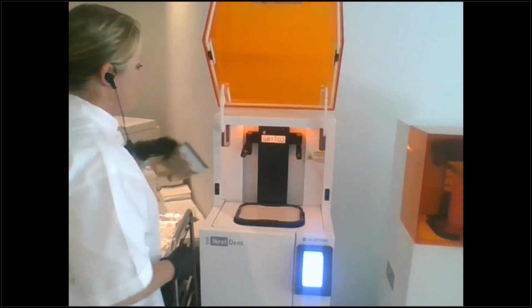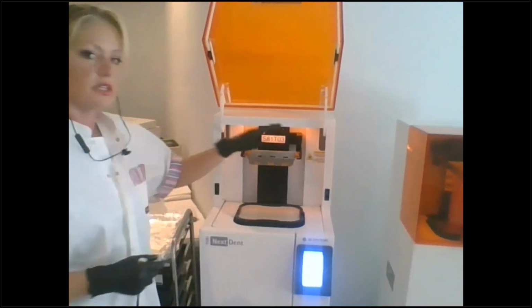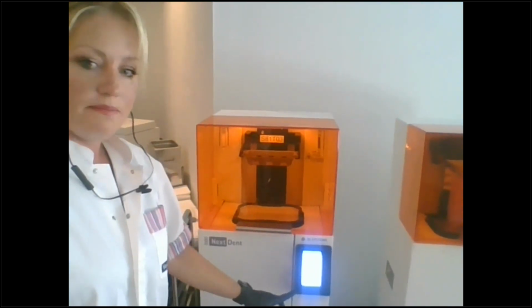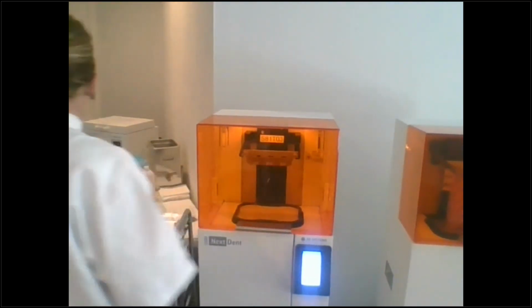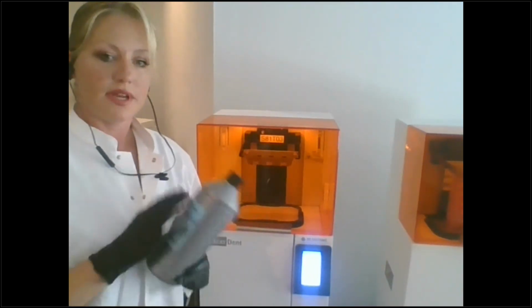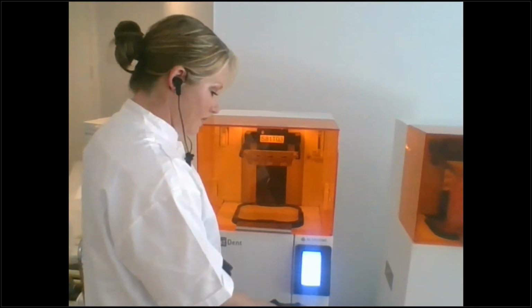All right, so let's install the build platform, and there's no screws or bolts or anything like that. You just put it on, it's all magnetic, very easy to install. One-handed is great. We're going to hit start job, okay? And we'll scan our bottle, scan the back barcode. The front is now non-existent, it goes for manufacturing, so it has nothing to do with the material for you. So use your back barcode.